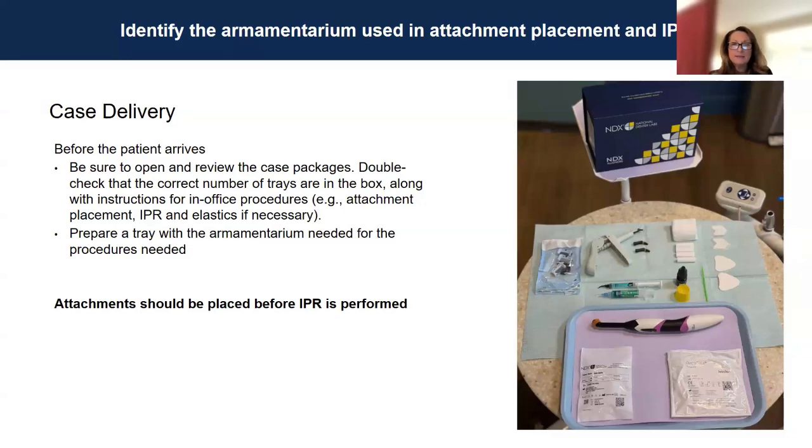And the reason is when you're performing the interproximal reduction, and that's something only a doctor can perform, we assistants or hygienists cannot do that. It is removing actual tooth structure. I like to tell the patients, if they do need it, that it's going to feel odd because it is like a sandpaper disc, right?